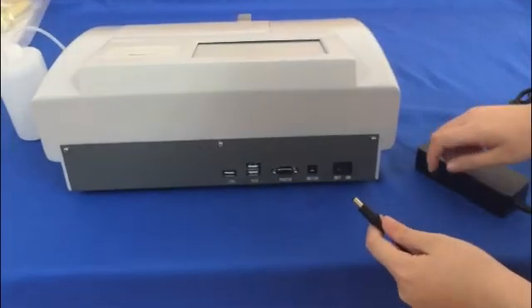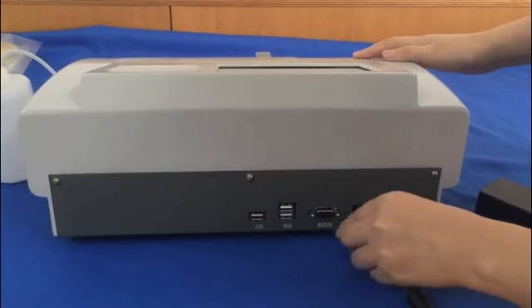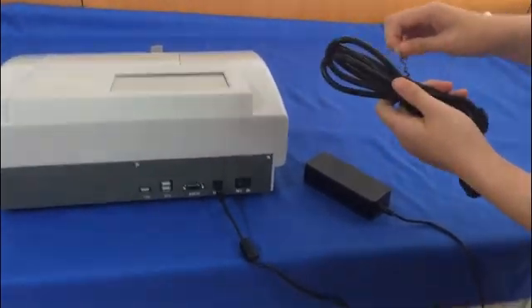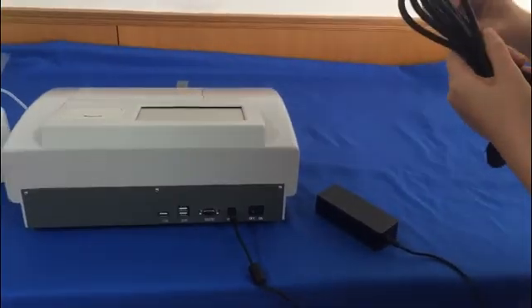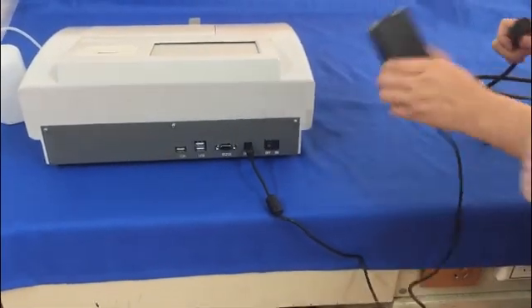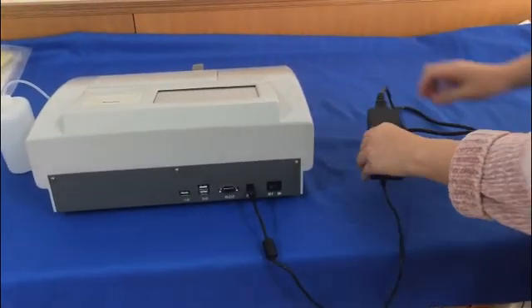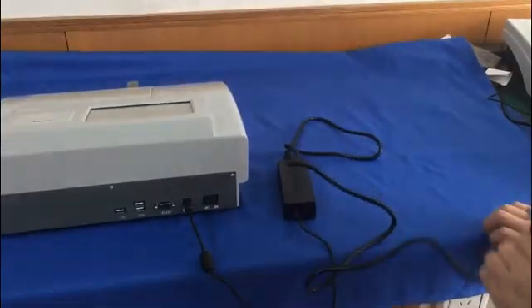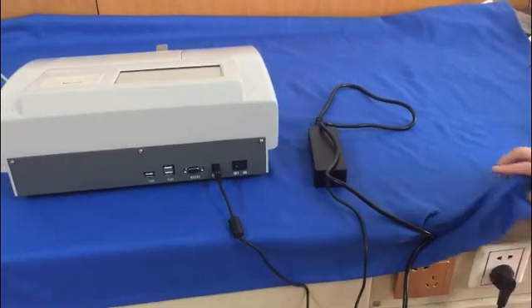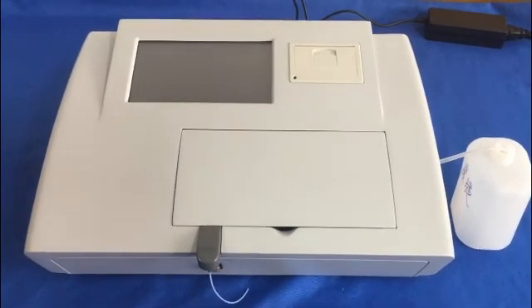Connect this port. Then connect power. Then turn on the power switch.